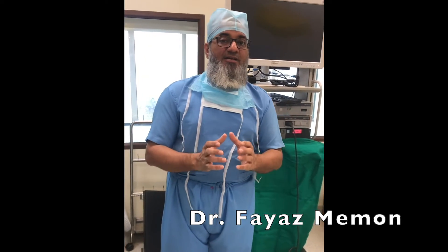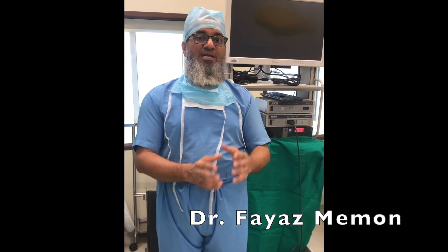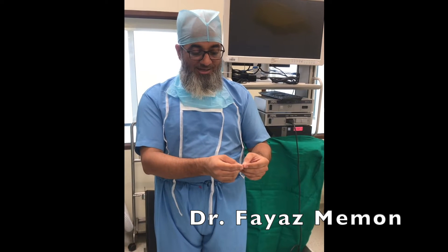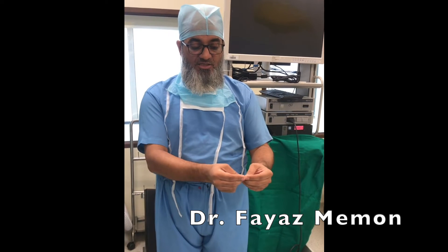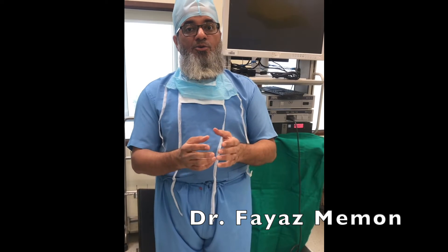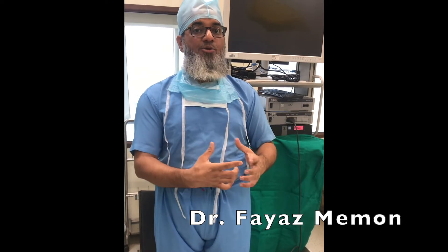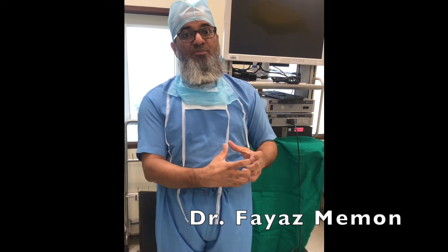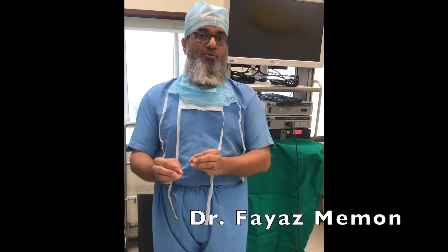The technique of arthroscopic knot tying is important because normally when you tie knots in your day-to-day life things are open and you are looking at the knot where you are going to tie it, and you have sufficient space. However when you are doing arthroscopic surgery you are outside the joint and you have to take these knots in a secure fashion by standing outside. So you need to know how it is to be done, which I am going to show you.